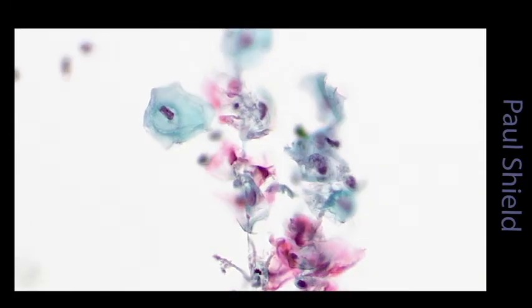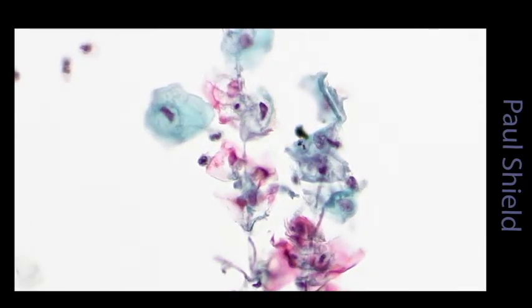It often collects around cells, and this is a characteristic appearance that you see, which looks like kebabs, some people think, where the individual hyphae sort of skewer the squamous cells and they look like they've all been run through by a pseudo-hyphae skewer. But if you follow it through, often you have to focus up and down a bit, you can see that it's branching and that it is segmented. And so that can be a bit of a clue to help find it.